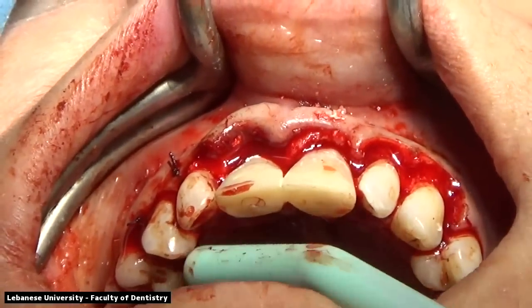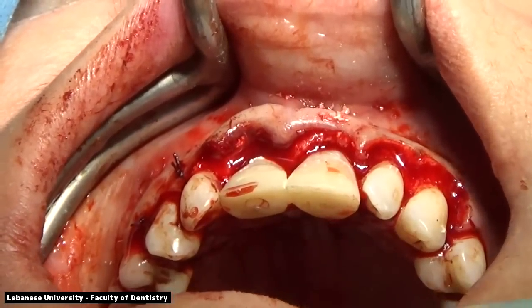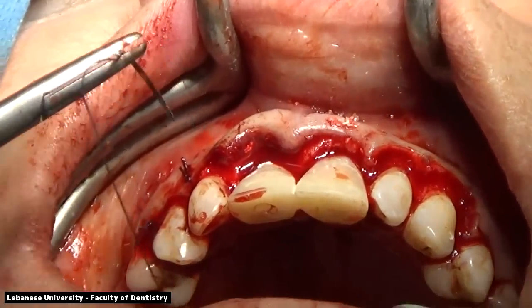The implants have to be placed slightly to the palatal and to engage a bit of the apical portion as well, which will give additional stability of this implant.